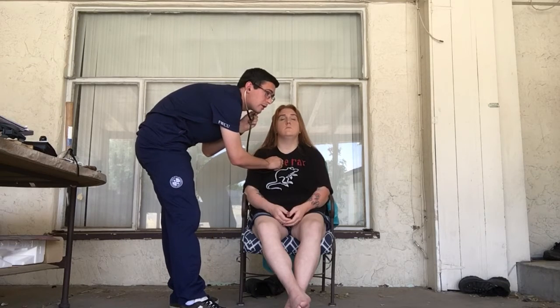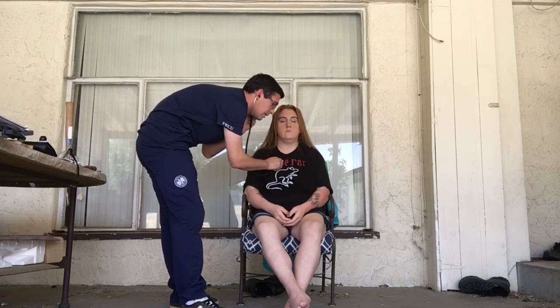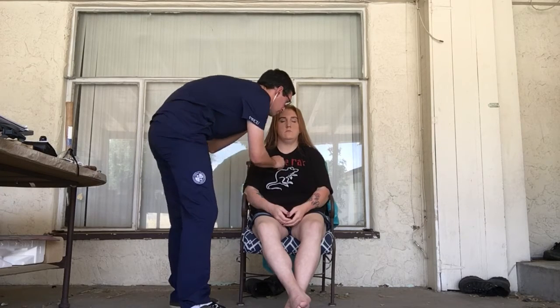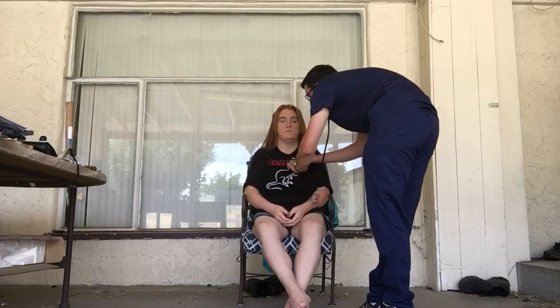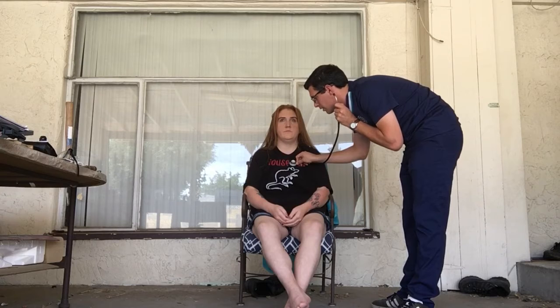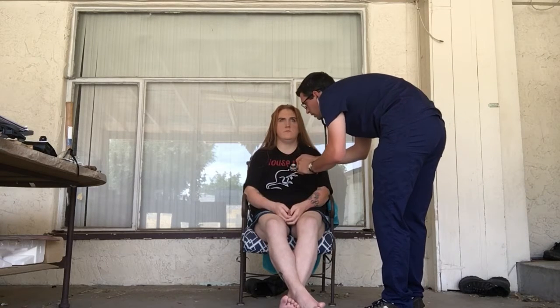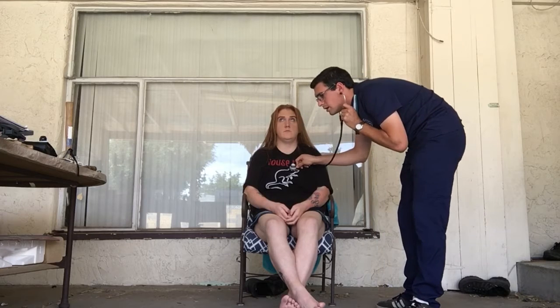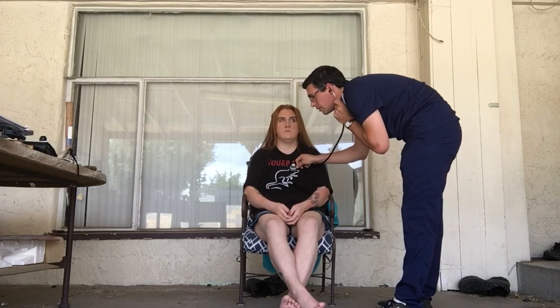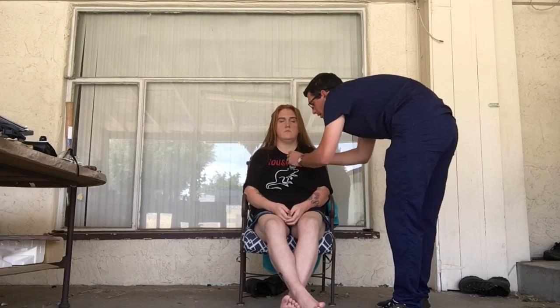Aortic, I'm at the second intercostal space, right sternal margin, and S2 louder than S1. All right, pulmonic, left sternal margin, second intercostal space, S2 louder than S1. Erb's point, third intercostal space, left sternal margin, S1 equal to S2. I'm going to listen with both the diaphragm and the bell.